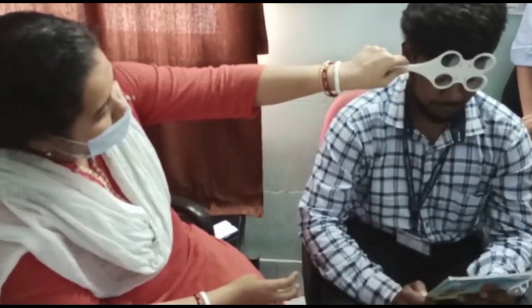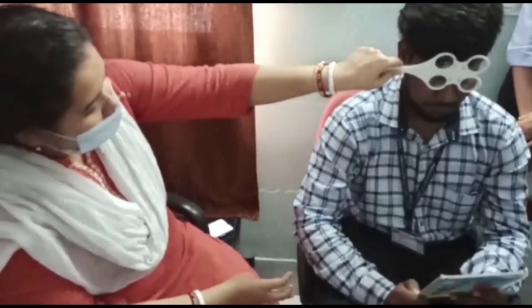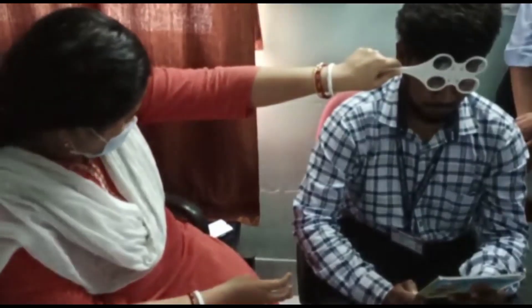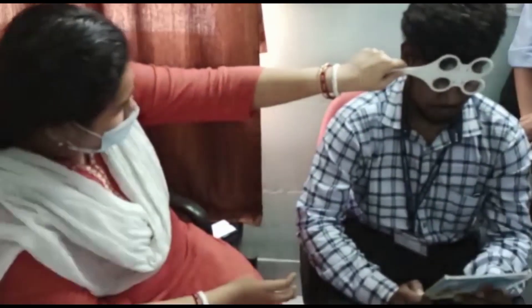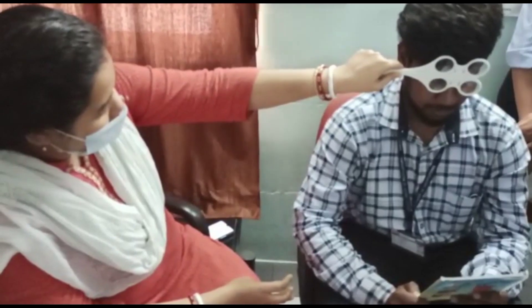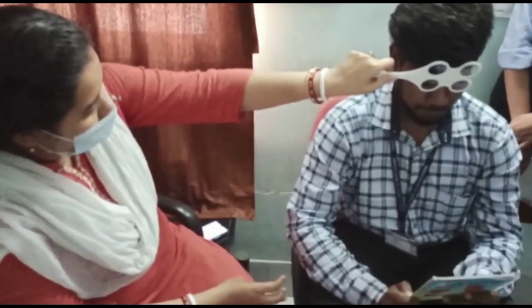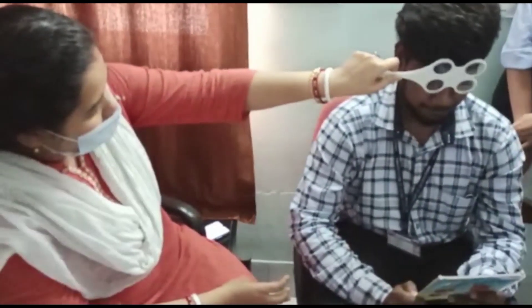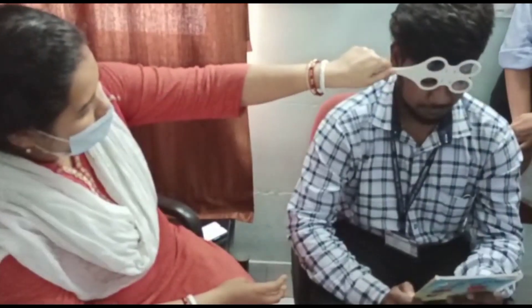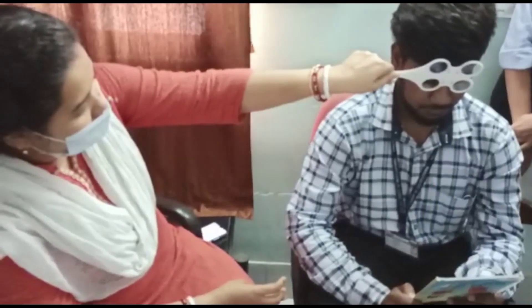Still blur? Yes, still blur. Okay. Blink, blink. Now? Blink and try to make it clear.